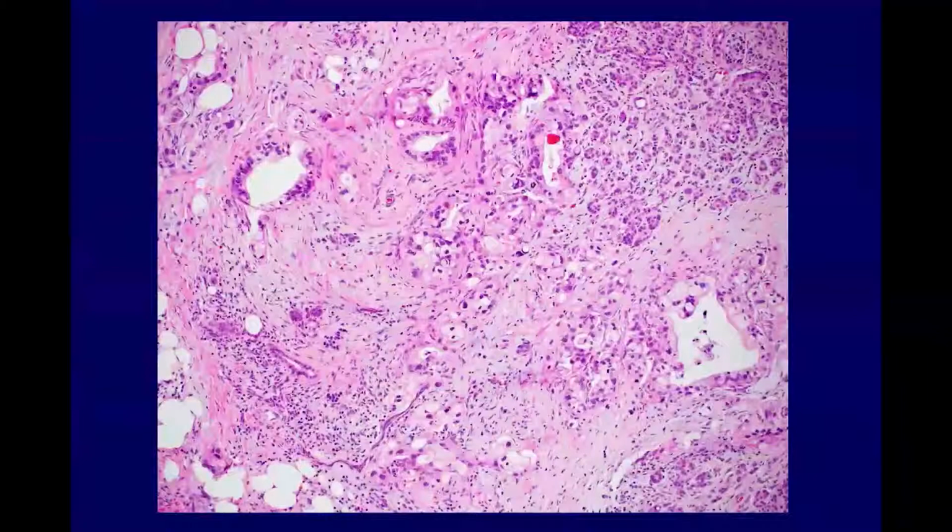All right, so here's a microscopic slide of the case we looked at originally, and we can see that we do again have desmoplastic stroma and lots of infiltrating cells. We can really see those cells infiltrating into normal pancreas. They have lots of marked cytologic atypia. We even see single cells. This is a fairly straightforward example of an invasive adenocarcinoma of the pancreas.